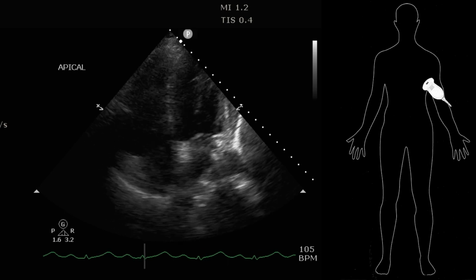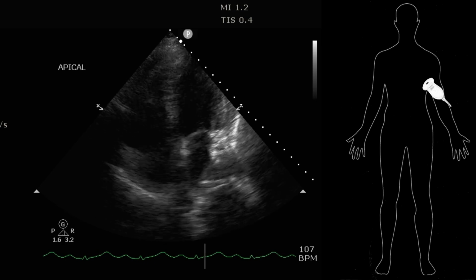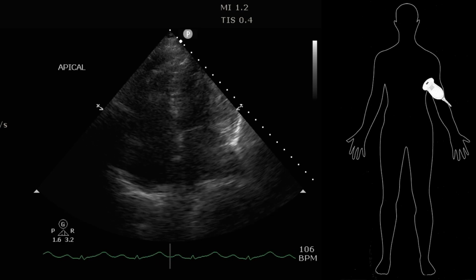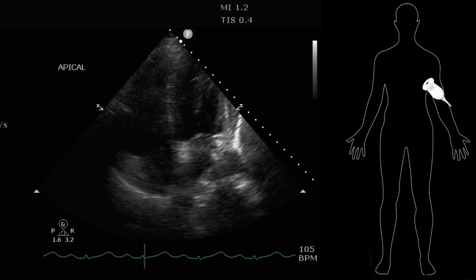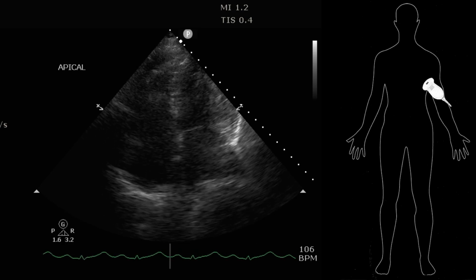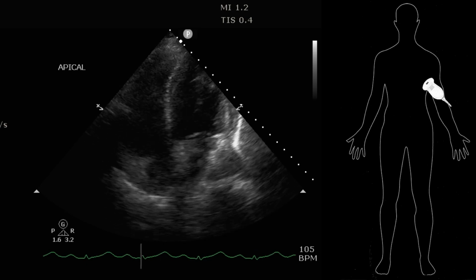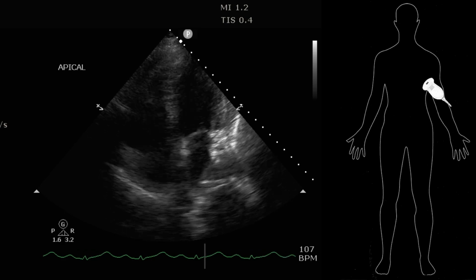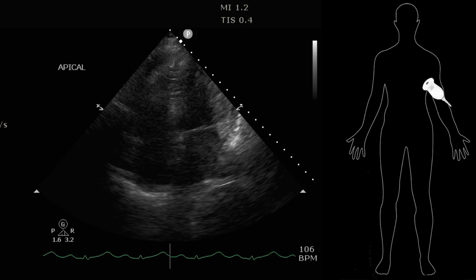And I want to twist my probe such that I can open up the ventricles to see their full width, and I can know that they're in the full width because I see the 2 different valves opening roughly simultaneously, right? And then if it's oriented properly, right, the left ventricle will be on the right-hand side of the screen, and the right ventricle will be on the left-hand side of the screen, right? And so we can see this is kind of where the probe should be, roughly on the chest, and the window that we're looking at getting, right?